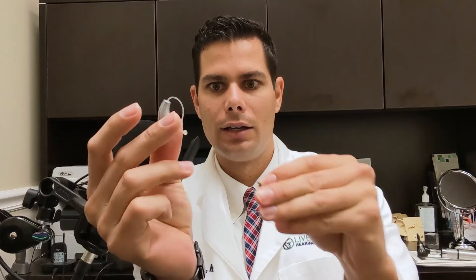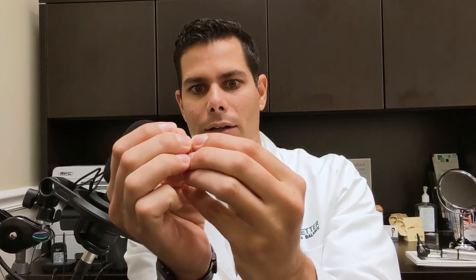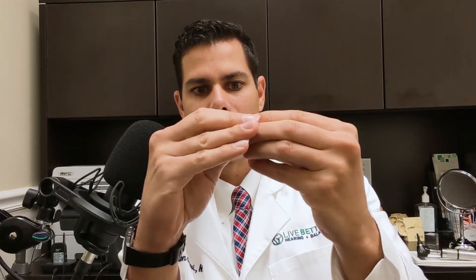One solution is going from an earbud — for example, on a receiver-in-the-canal style hearing aid — going from an earbud that is open to one that is closed. Here's an open earbud, and that leaks out a lot of sound. It's designed for less hearing loss. Then changing it to one that seals in the sound better, so you'll get more power out of this because more sound is going to the eardrum.